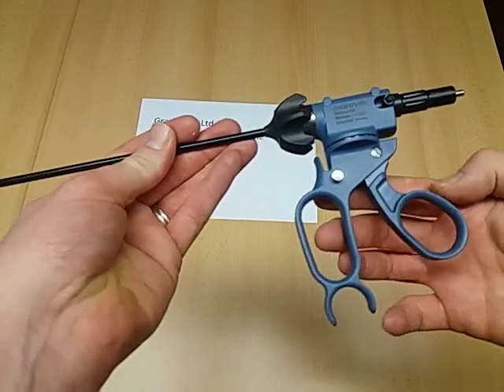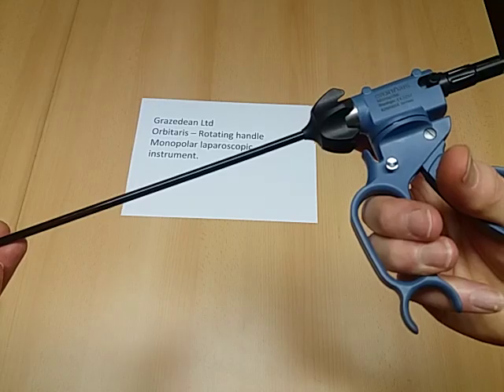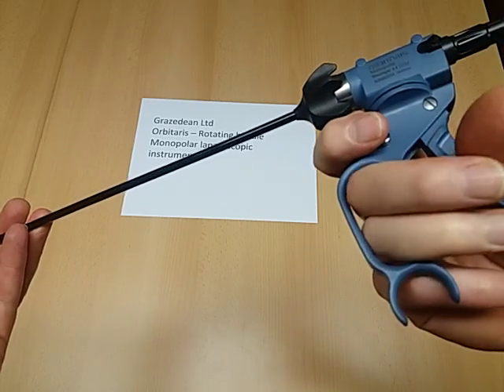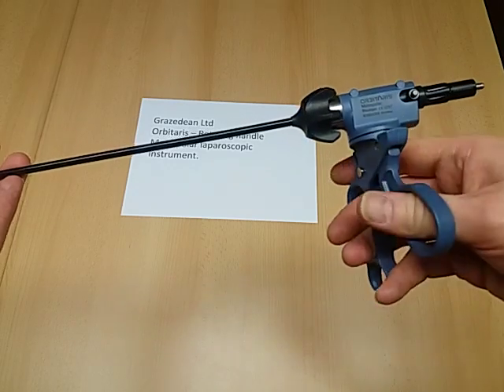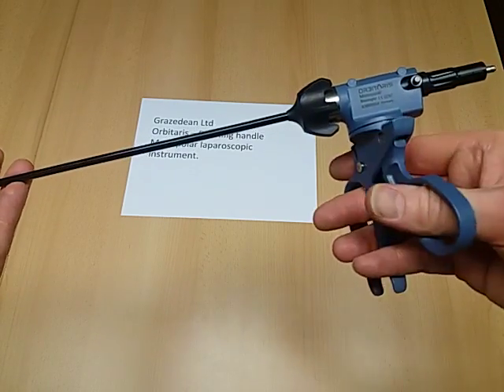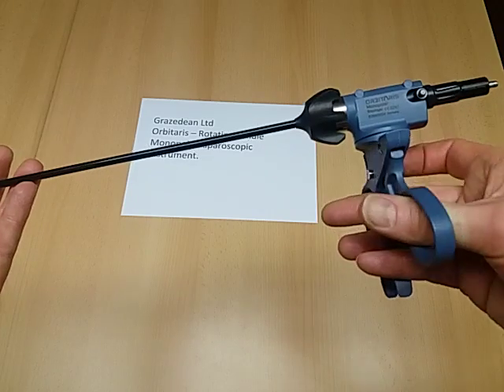The handle itself has a locking mechanism which can be used with a single finger to release the handle, allowing full rotation of the handle relative to the shaft.